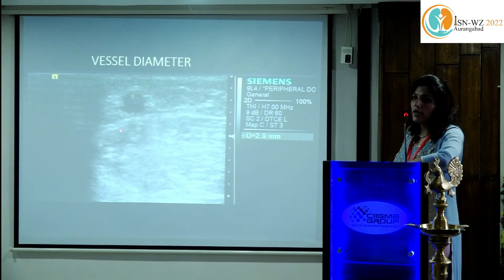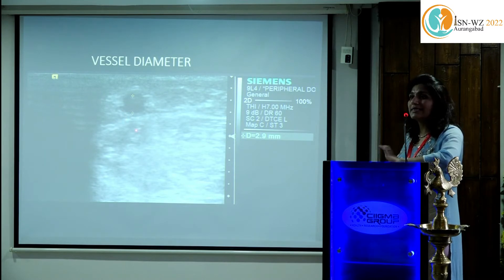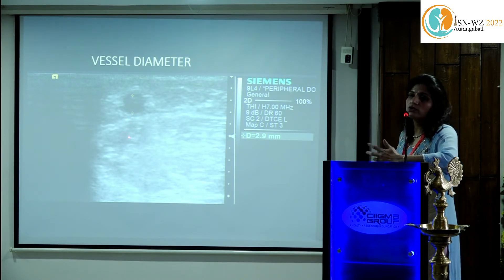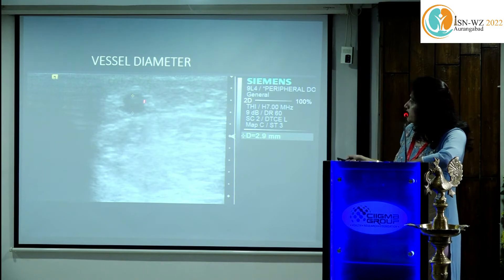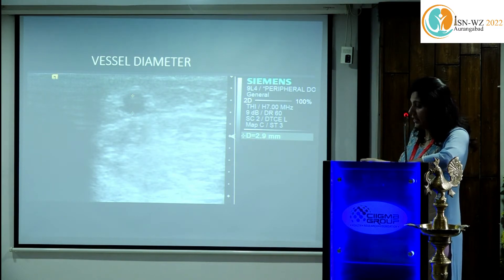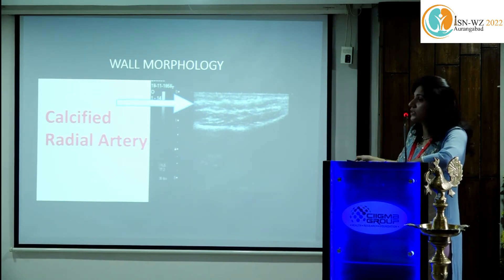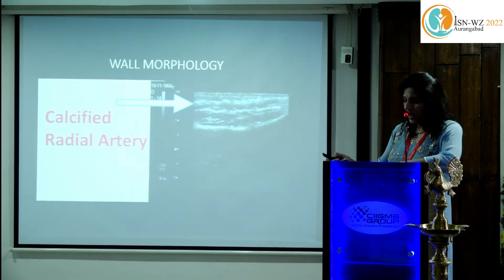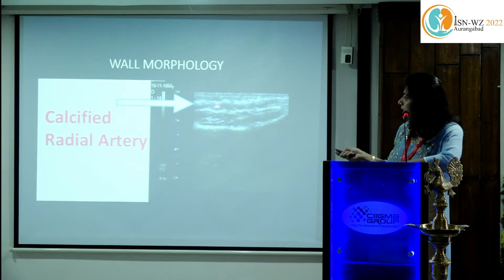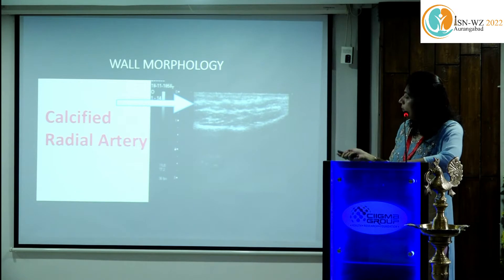Vessel diameter alone is not enough. If the artery has a good diameter but shows significant atherosclerotic changes, anastomosis is difficult due to atheromatous plaques, and the vessel may not dilate — so the fistula won't mature. Wall morphology is very important. Here we show the radial artery measuring 2.9 mm at the wrist with a regular wall, in contrast to an artery showing heavy atherosclerosis — such arteries should be reported so the surgeon avoids them.